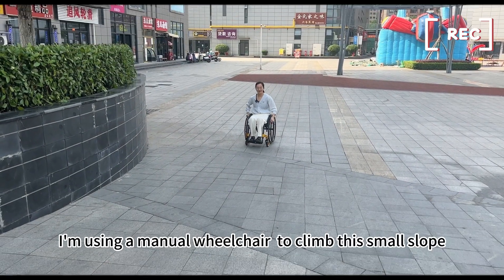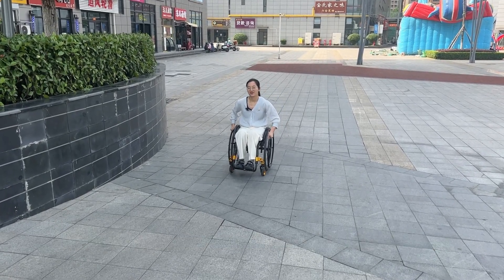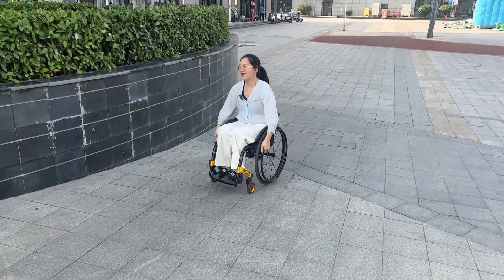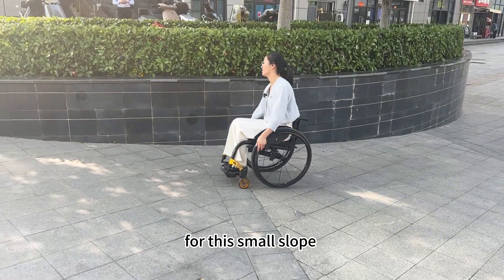Round one. I'm using a manual wheelchair to climb this small slope. It takes so much power to pull it. You need strong muscles to do it for this small slope.